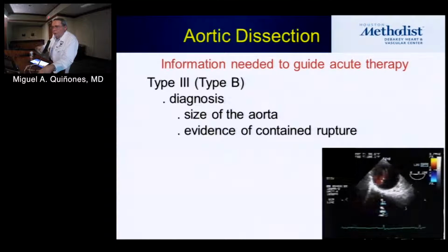We've seen a few cases here, and we haven't missed them. Even though the first time we saw it, we had never seen one before, but it's so apparent that you see a color jet going someplace where it's outside the aorta, it's a cavity, there's a lot of clot formation in that pseudoaneurysm and so on. It's not a difficult diagnosis to make.